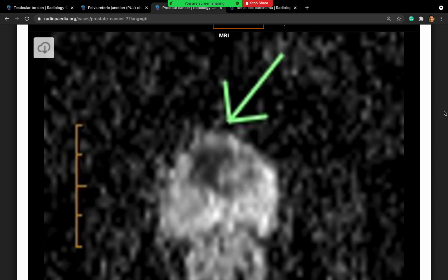Of course, once you explain this, the next question will be, what is T1, what is T2, which you started telling when you were explaining to the patient also. That is fair enough. MRI is a very standard investigation for prostate cancer. So T1, T2, diffusion weighted image, and ADC should be very clearly understood, at least by definition. I think you did well. I can't find any issues in that, except maybe you can make the answers a bit crisp so that you may have more time to go through the images.